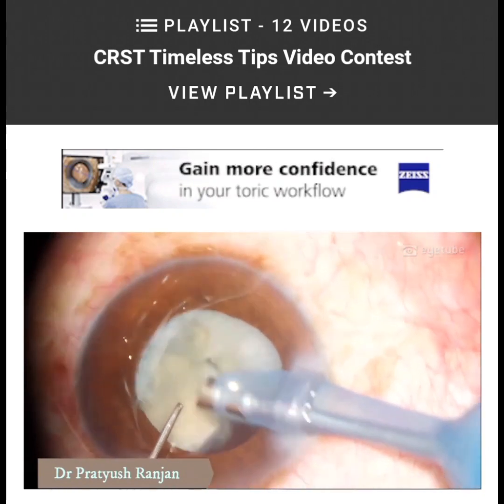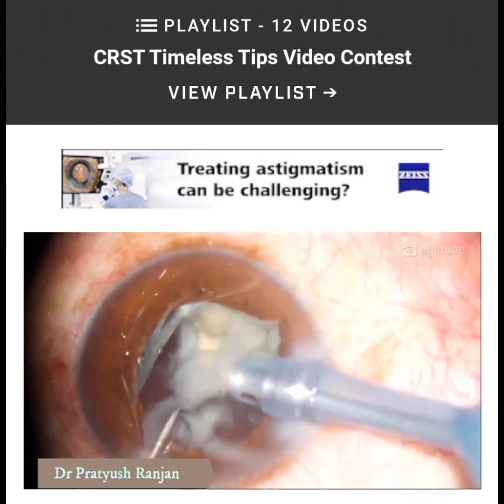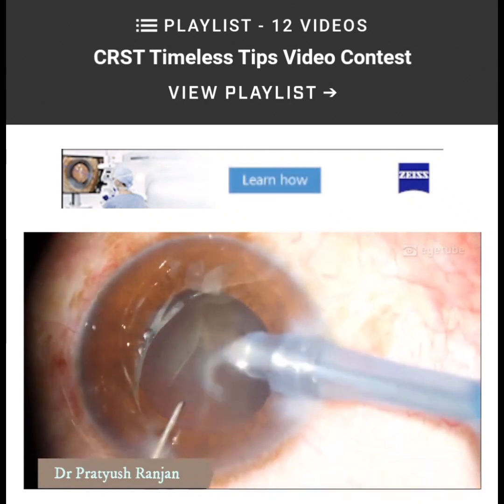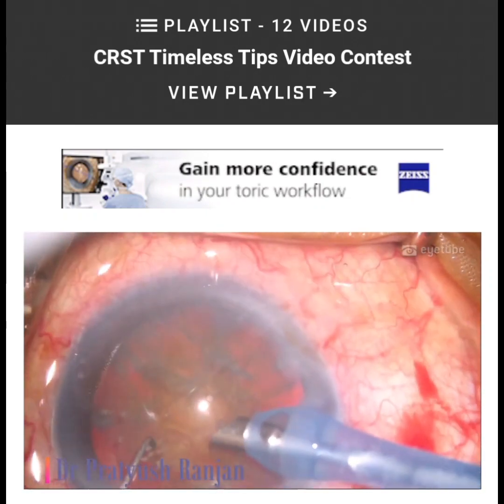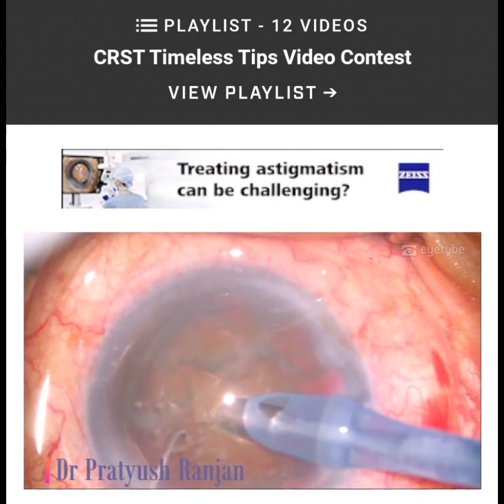So that's how a hard white cataract is sculpted and emulsified. Another technique, another video in which I have tried to explain this in a slower version.